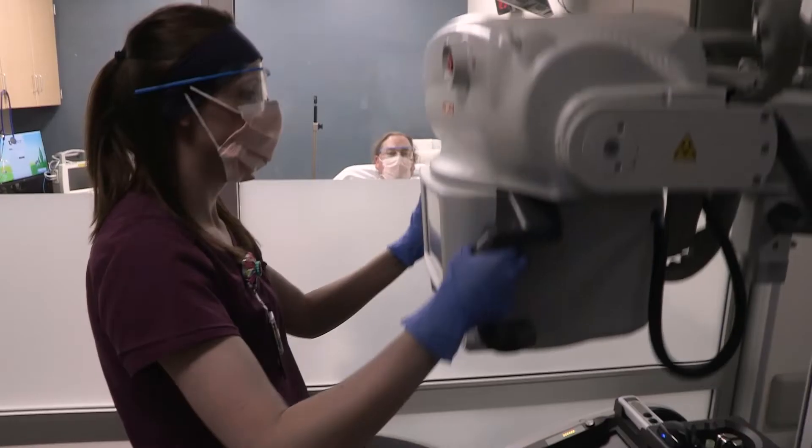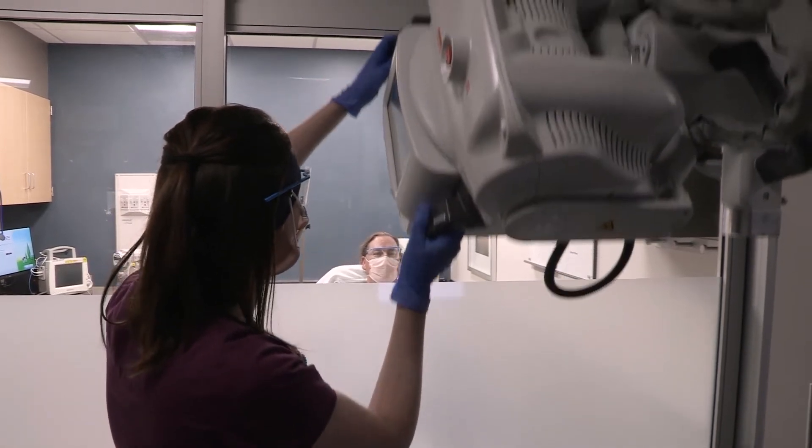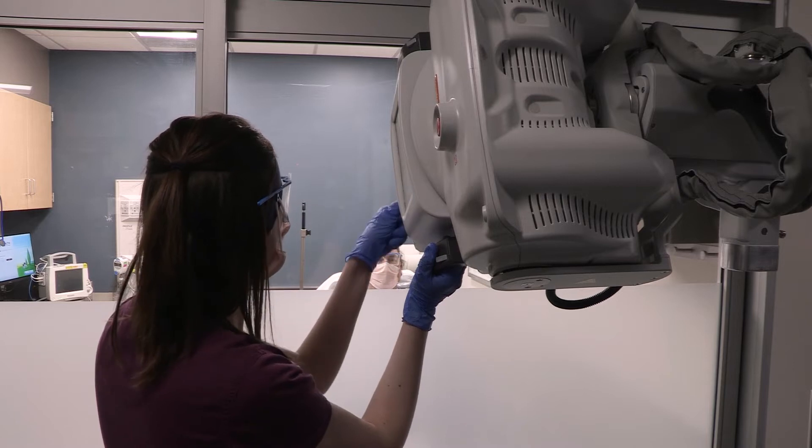Next, the technologist will adjust the position and angle of the x-ray machine as needed. The technologist may ask the nurse, through the glass, to adjust the patient position.